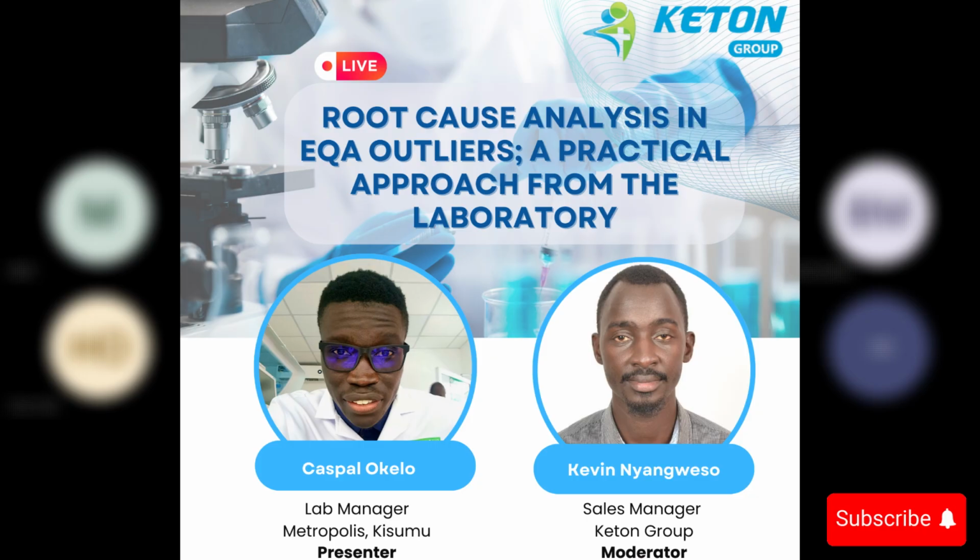Some of the common monitoring methods that you'd implement will be like reviewing subsequent EQA cycles. My uric acid failed this month. I implemented corrective action. Yes, I calibrated my reagent. I need to monitor next month in case uric acid fails again. Another way of monitoring is to analyze QC trends. If you had a bias, you have to monitor if your mean returns to the target and there's no drift. You'll be checking for Westgard rule violations.